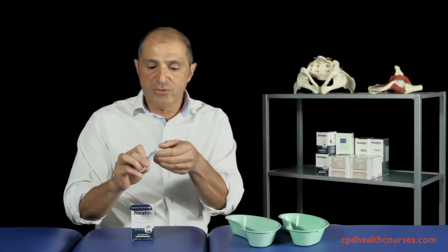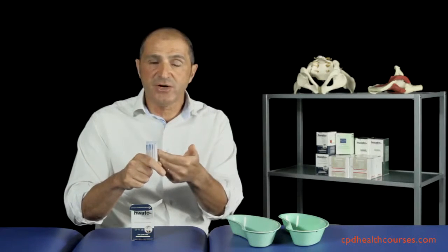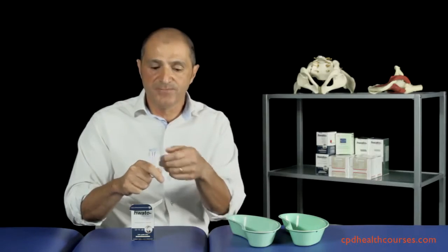Let's have a look at how we remove the needles from the blister pack. Remember, inside the blister pack they're sterile. Once you remove them, they're not sterile, so you really need to use them straight away.